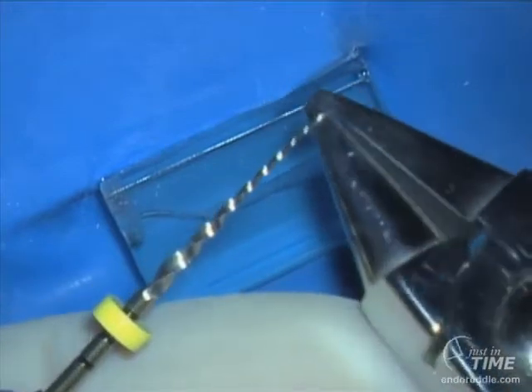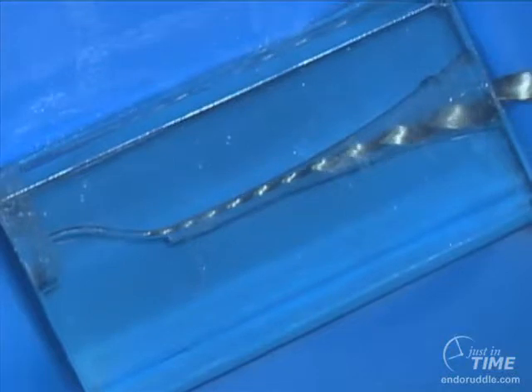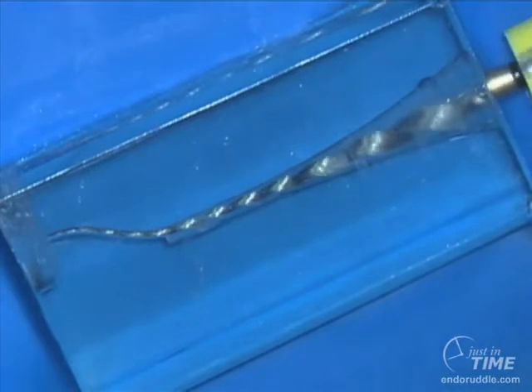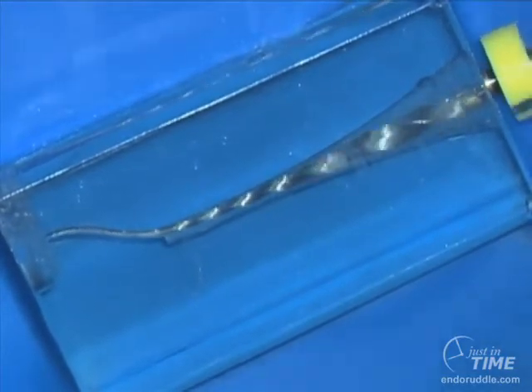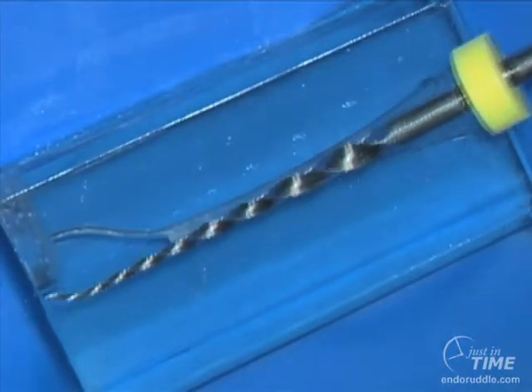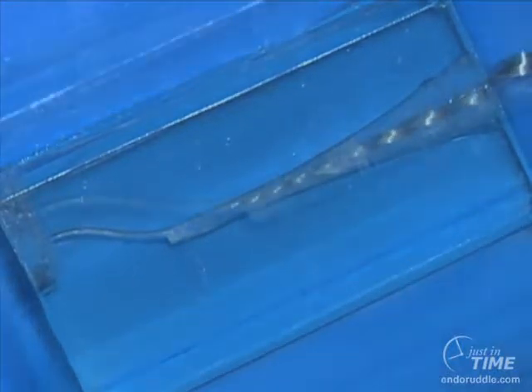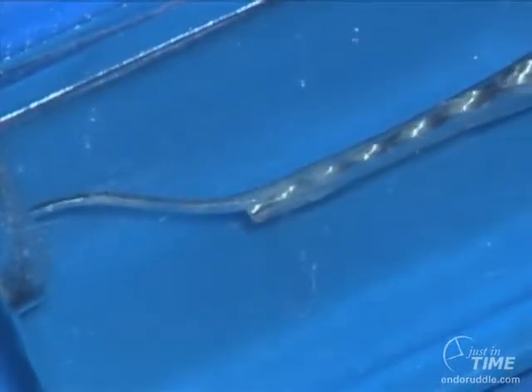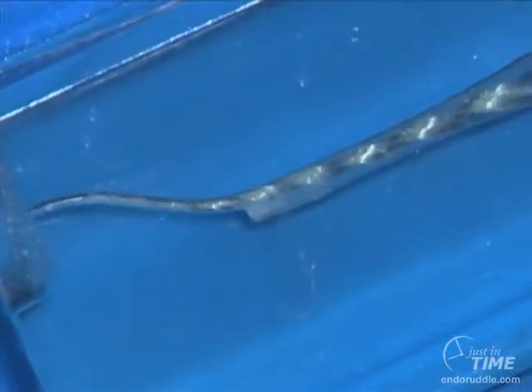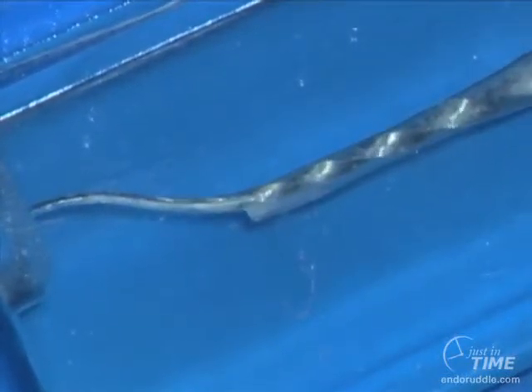Here we are using the orthodontic bird beak plier to pre-curve ProTaper and to convert ProTaper into a manual instrument. The motion, once you've bypassed the ledge, is just a rotary motion, like the motor would drive the file if it was mechanical, so the operator manually simulates pretty much the motion that the motor would place on the file. The S2 or Shaper 2 from the ProTaper family is pre-curved. Again, the whole trick is to get the instrument into the secured part of the canal apical to the ledge.